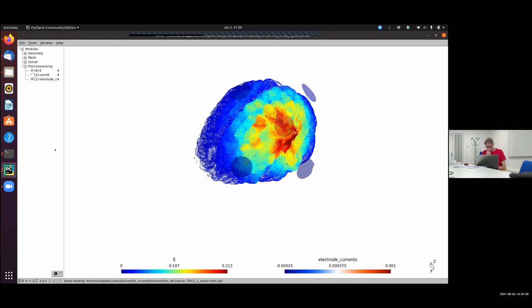Now, when you want to set a threshold, the tricky question is more on a scientific level, not so much on the simulation level, namely which threshold do you use? Ideally you would use an electric field threshold where you know that when I'm above this threshold, then I'll actually get my neural effects of my stimulation. But this is extremely tricky. I think there we still need more research to get reliable threshold estimates, and it will differ between subjects, and also between brain areas, so that's quite tricky.